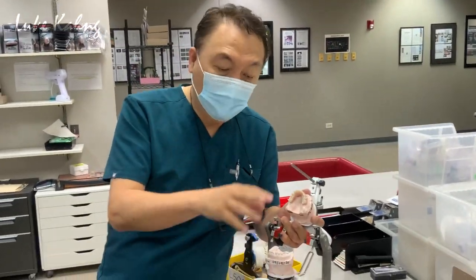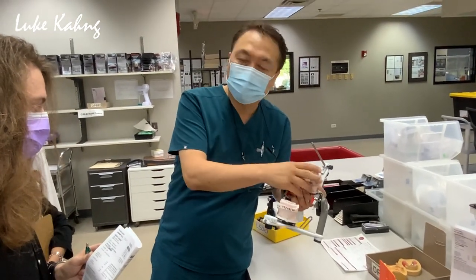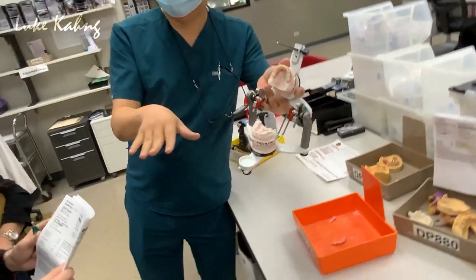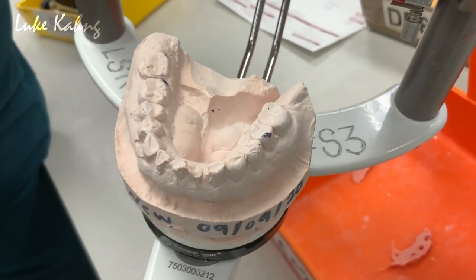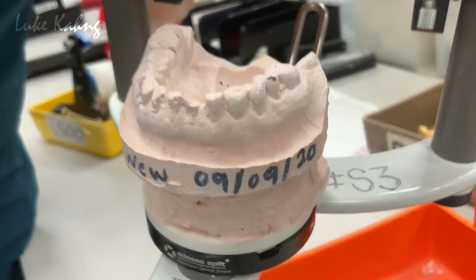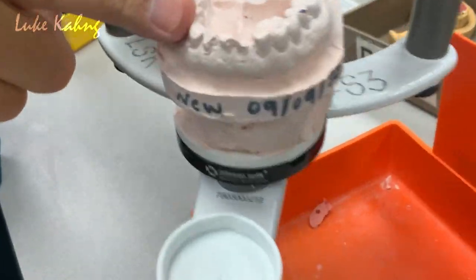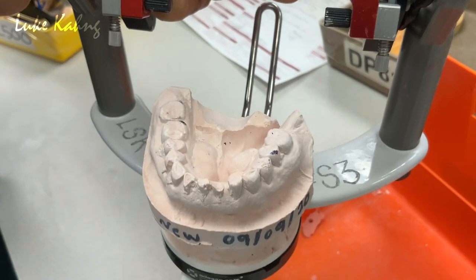So number one, why this? They made it three or four times, and other laboratories fracture it all the time, even though it is monolithic zirconia. I have to look at the lower teeth. Look at this, the lower teeth are gone, from small grinding. This lady grinds all over the place. So regardless, it's one work. They fractured it four times, which is the other laboratory. So that's my evaluation for this. This is a problem. I understand people don't have any money. I got that. They want to fix this, understood.